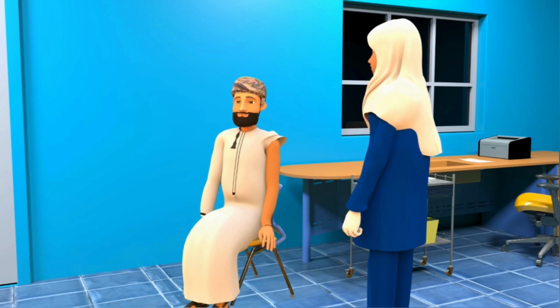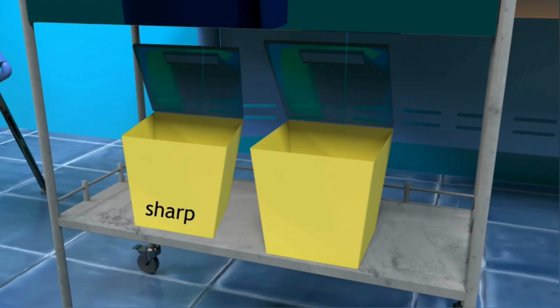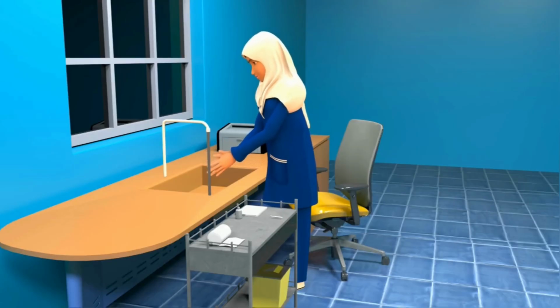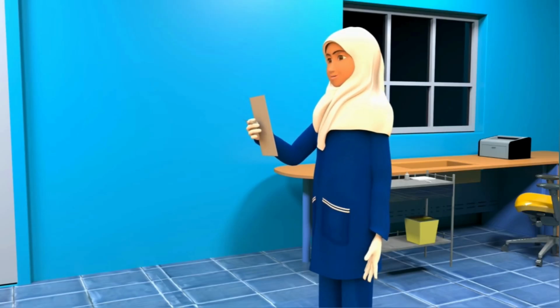Monitors for any adverse reactions at the site for 20 to 30 minutes after the injection. Discards all equipment appropriately. Removes and discards the gloves. Performs hand hygiene. Documents the procedure, date, time, name of medicine, dose, route, and signature. Reports any unexpected outcomes.